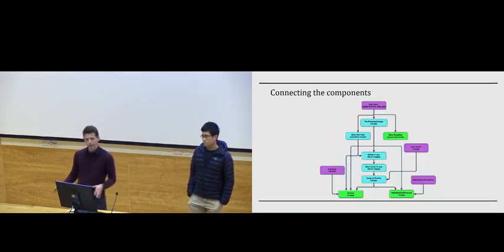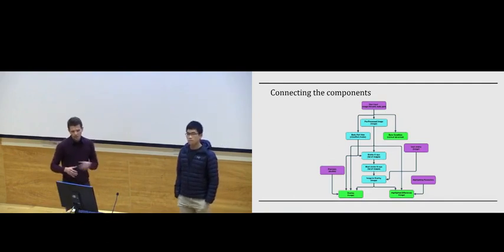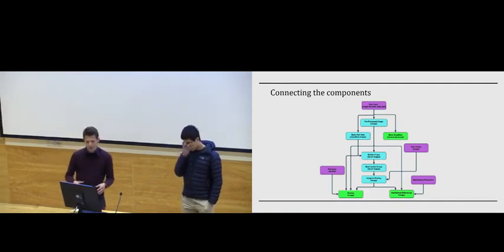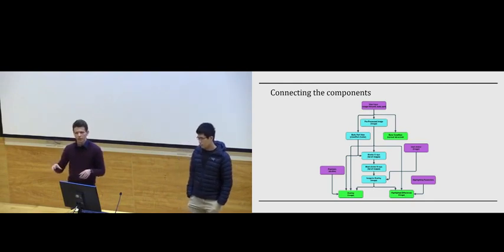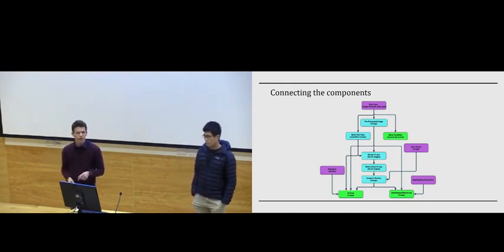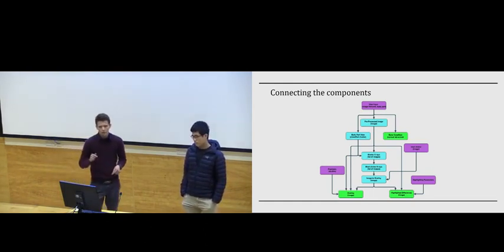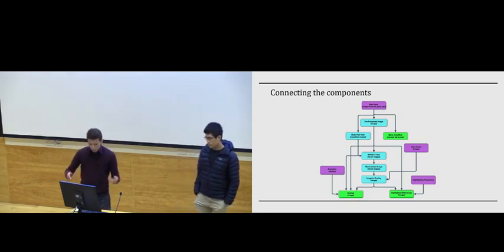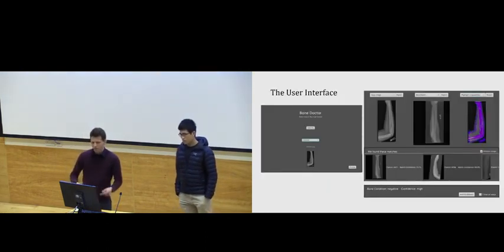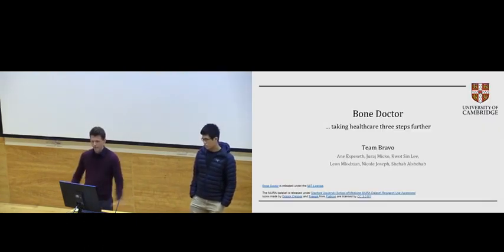This is the pipeline, basically a simplified version of how the components are put together. It's not really that important, but basically it's a computational graph that recomputes whatever is needed whenever any of the user input changes, including the algorithms that the user can choose. Although we do not do user interfaces, we do science, yet we have created a user interface for the clinician to preview the results. That's it, thank you.